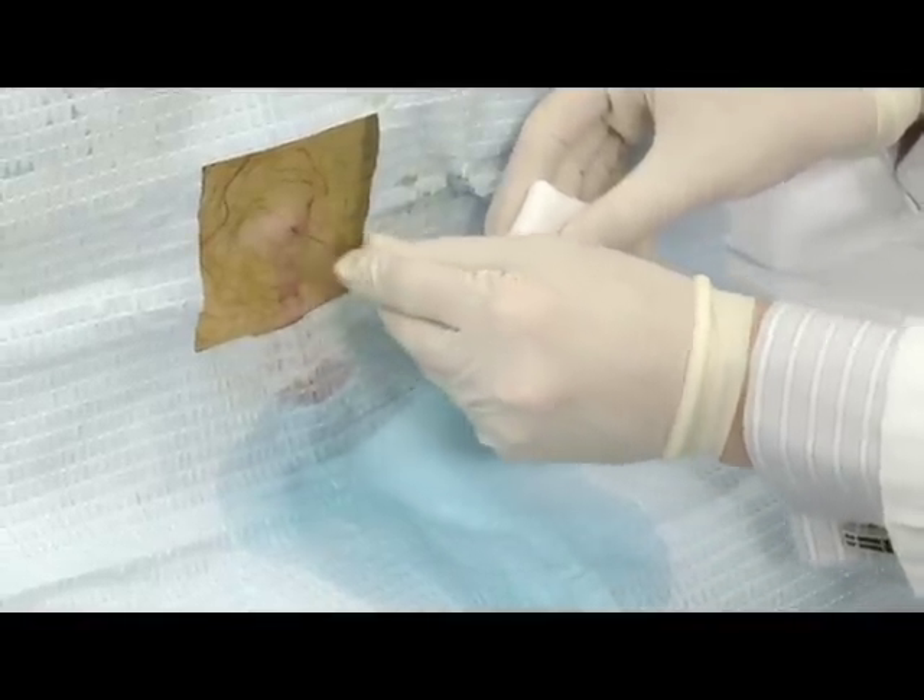Once you collect an adequate specimen, replace the stylet and withdraw the needle. Hold pressure with a piece of gauze for a minute, longer if there is any bleeding at the insertion site.